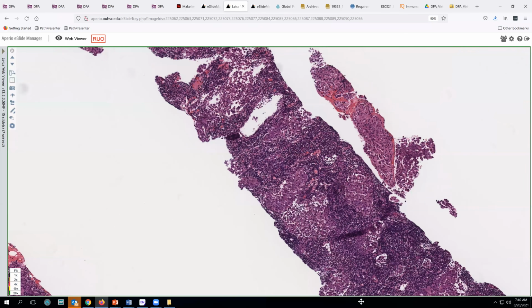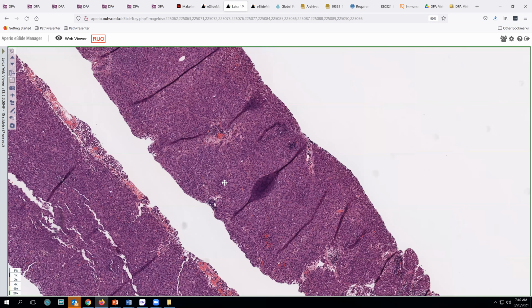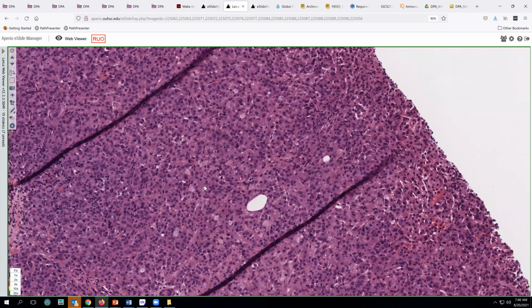And then we've got broad areas of the node that are essentially totally replaced by the tumor. Now, conventionally, the Nottingham classification scheme is not applied to breast tumors in other sites, for example, in the lymph node. And so it would technically not be appropriate to give this a Nottingham grade on the basis of the usual criteria, because really you've lost the predictive value of the architecture.